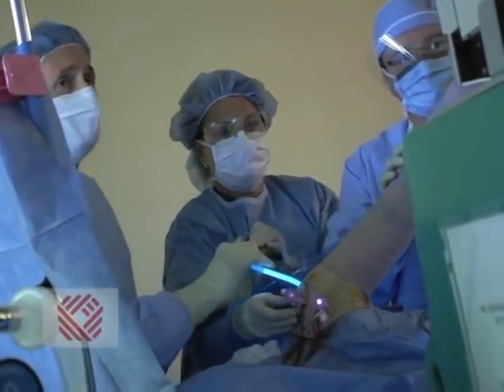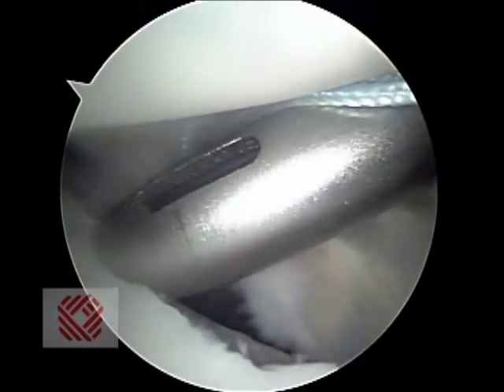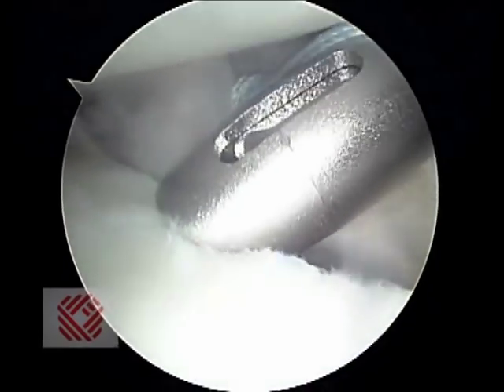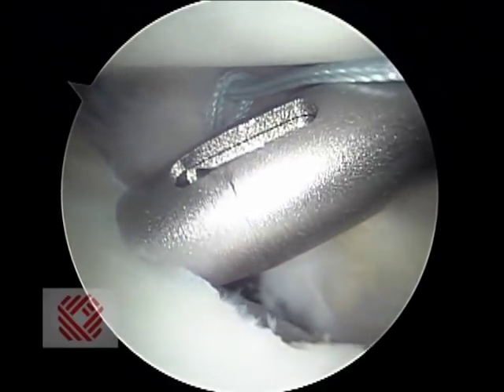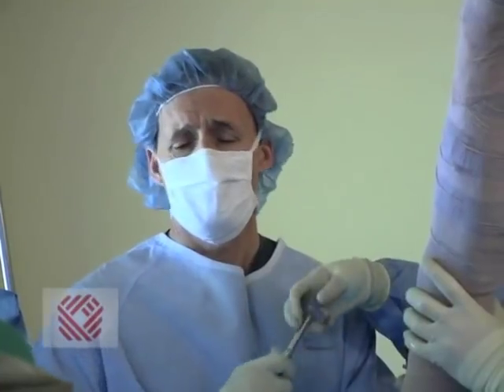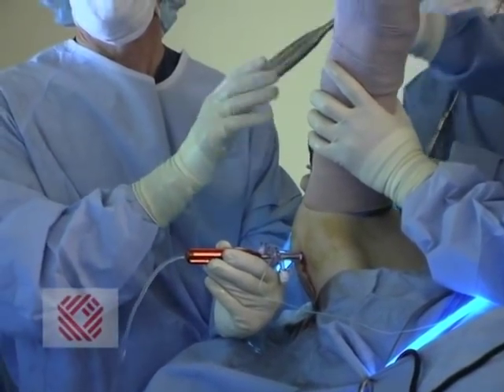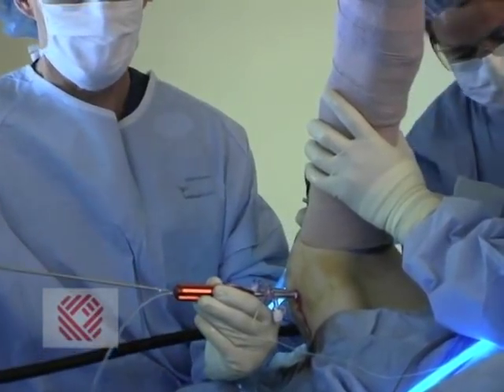That's our cinch knot. Now we're going to put our implant in — a little bony implant made of material that dissolves. We'll be above our repair stitch, and we want to position it right on the edge of the glenoid. Now we're going to drill a little tiny socket.